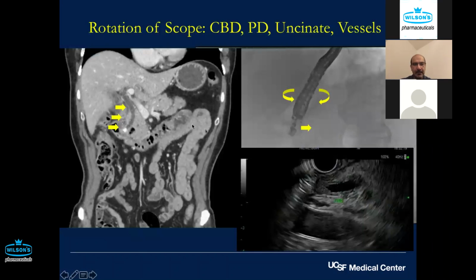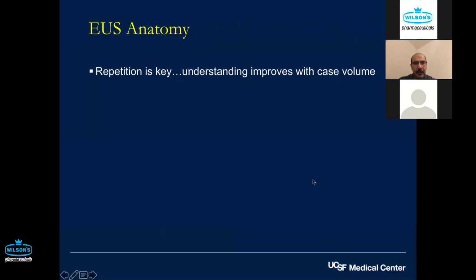On this patient, as you go more counterclockwise, you're going more posteriorly, and you can then follow the bile duct up. Similarly, you can follow the pancreatic duct. Incidentally, this is a CT scan of a patient with a stone in the distal bile duct, but the ultrasound is not that patient's. Anyway, you can follow the bile duct up. Now, we're not talking about therapeutics, but when we do rendezvous, this is where we puncture the bile duct distally and then advance our wire here.